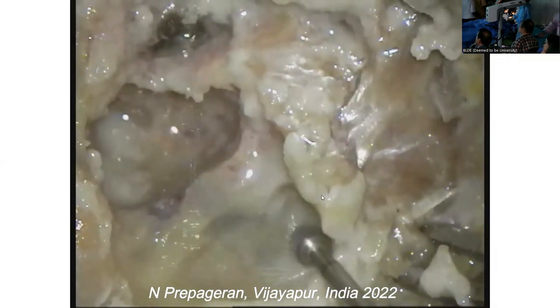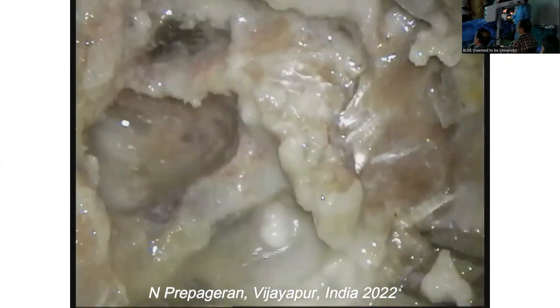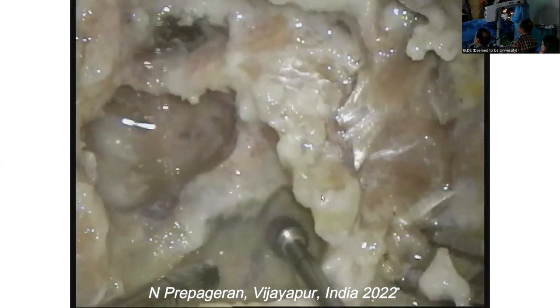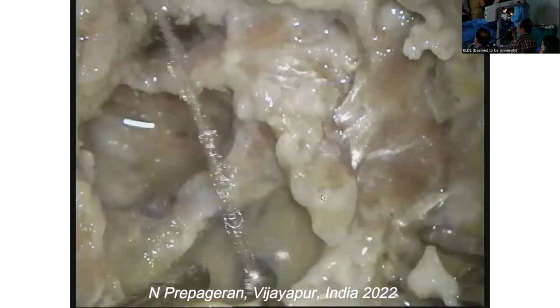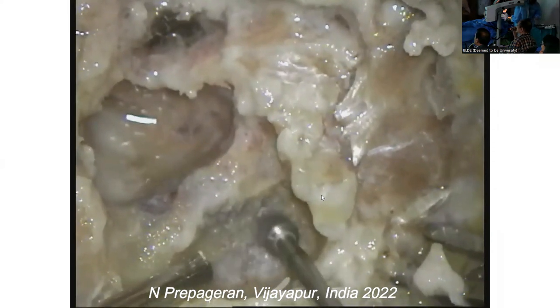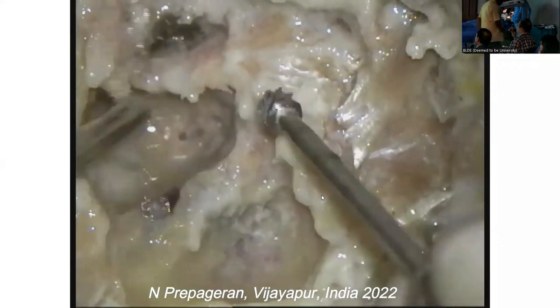Okay, that's it. So for retrosigmoid, you can go all the way down. Okay. That dura. Guys, can you see? Yes, sir. So once you have dura, you can just nicely expose the dura. Okay. That's dura of retrosigmoid, okay? Yeah. The same way.